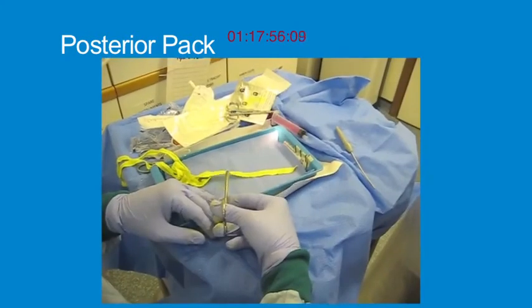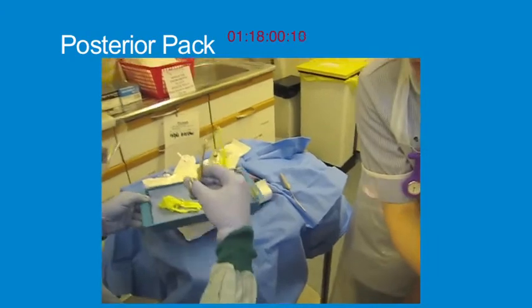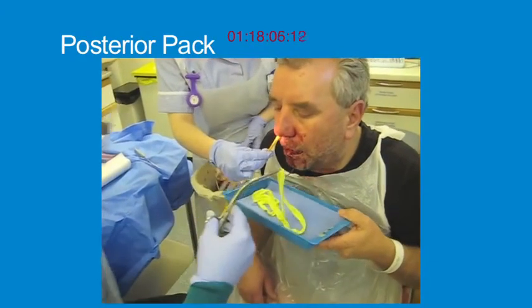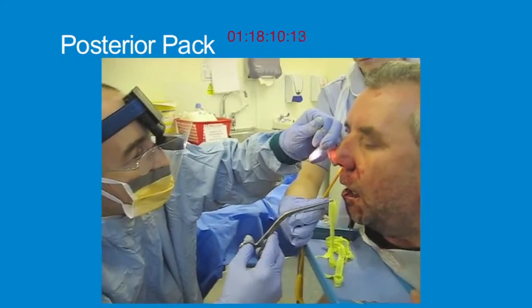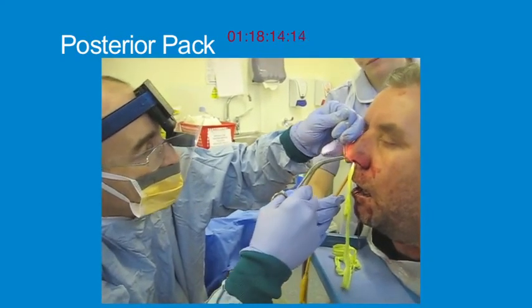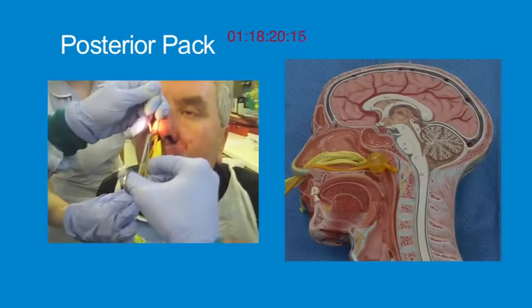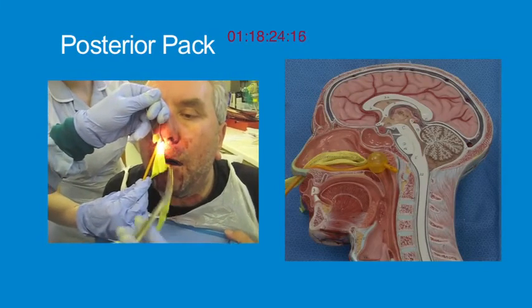The Foley catheter posterior pack is combined with a BIPP anterior pack. Grasp the BIPP ribbon gauze about 10 centimetres from the end with Tilley's nasal forceps. Ask the nurse to support the head. Keeping the head level with the floor of the nose in the horizontal plane, insert the BIPP along the floor of the nose. This creates a double layer of BIPP. Remove the forceps and grasp the BIPP ribbon gauze about 8 centimetres from the nostril and insert another layer above the first layer. In this way, continue to layer the BIPP, working superiorly.